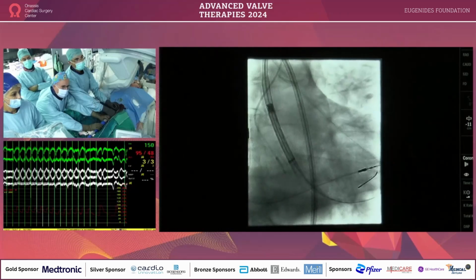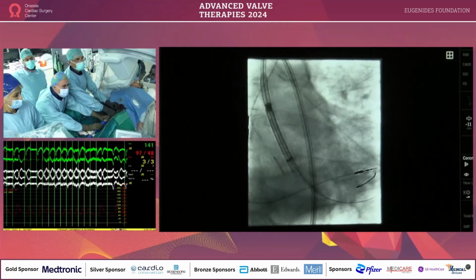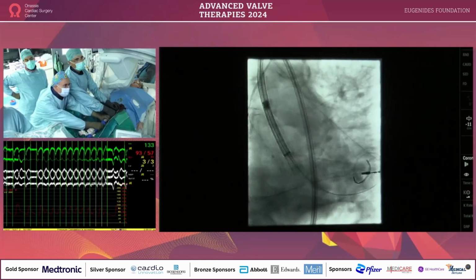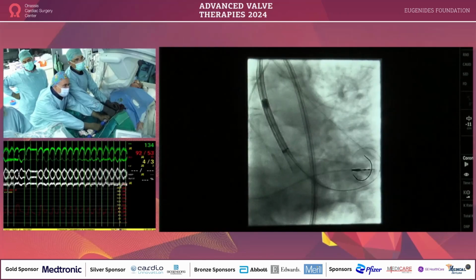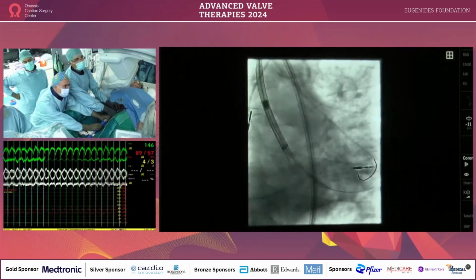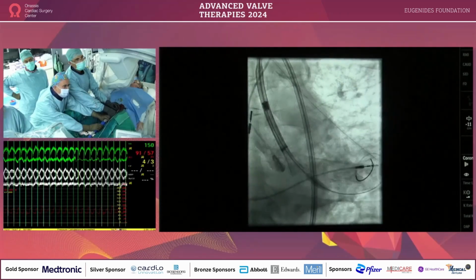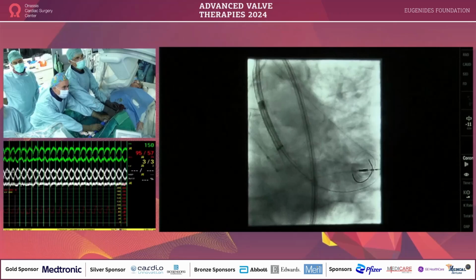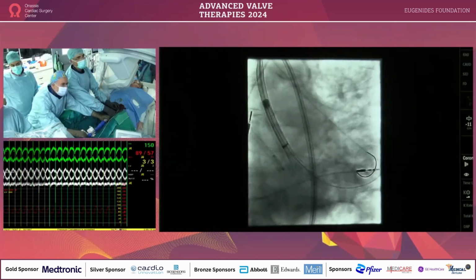Don't talk to him, guys, don't let him take deep breaths. We gotta go fast now. You gotta release fast now. You're in the fast release phase. Injection again, please. Keep going and pull it up a little bit. Push on the wire. Let's go fast though.